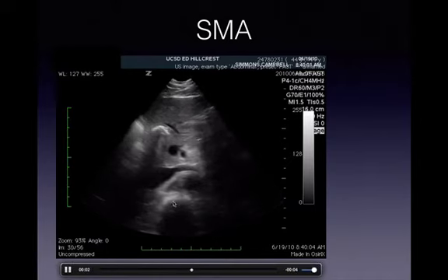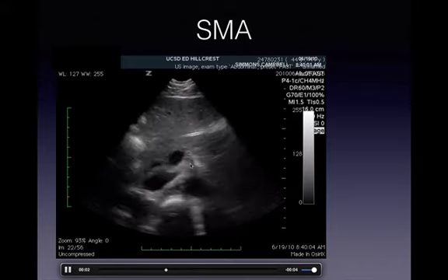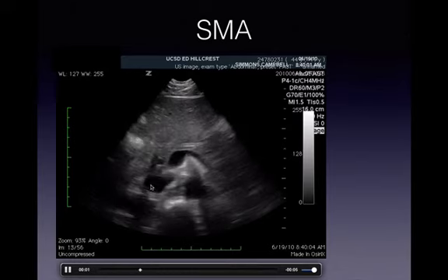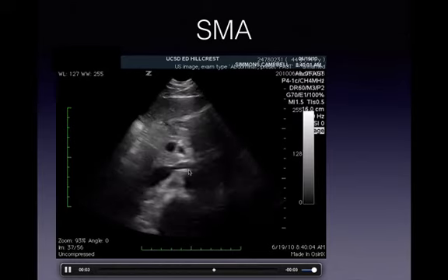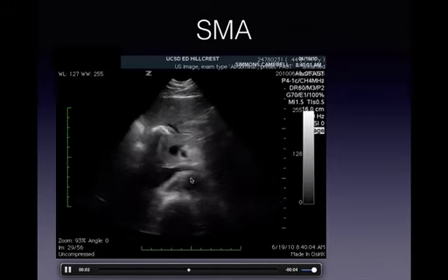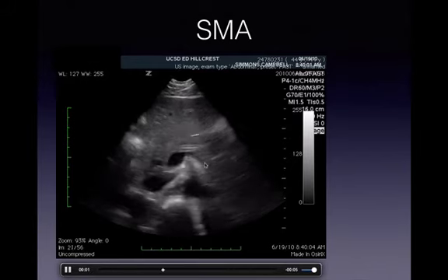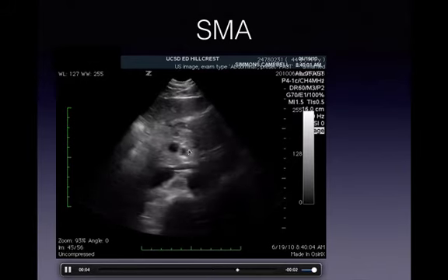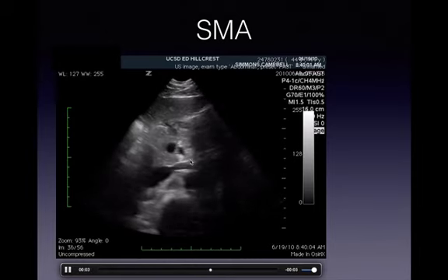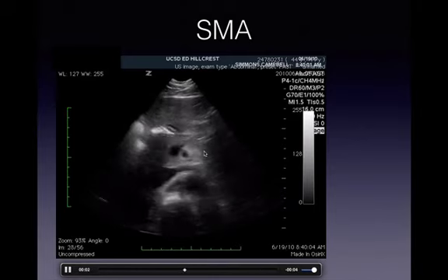This is an example of spine shadow, aorta, and SMA right here, surrounded by thick white mesentery. Here we're going to have the inferior vena cava giving off the left renal vein in between the SMA and the aorta. Above the SMA, we're going to see portal confluence coming up and around to meet the splenic vein. This is a good area to know because whenever we see SMA, we know that it lives right behind the pancreas. So this is actually the head of the pancreas.